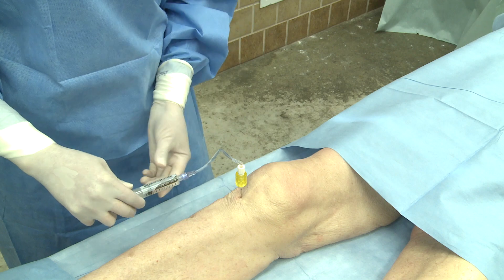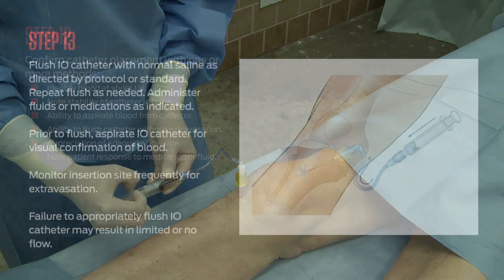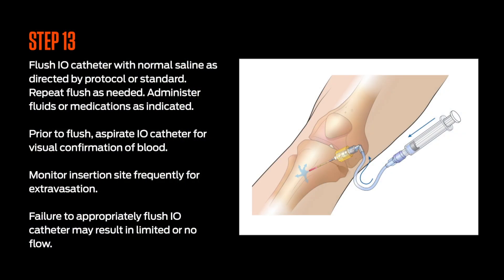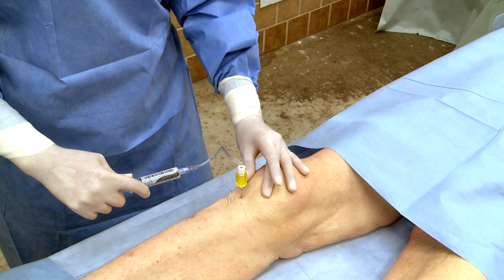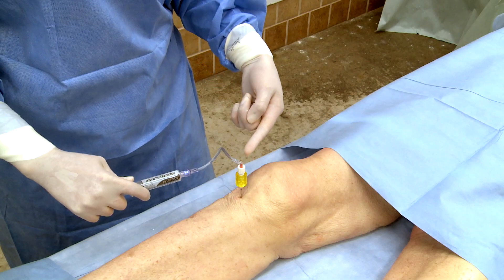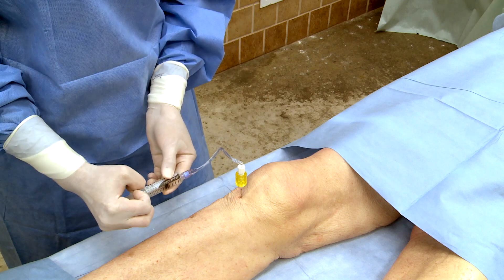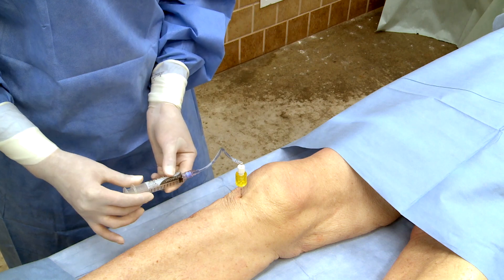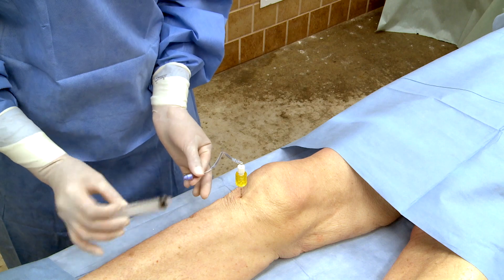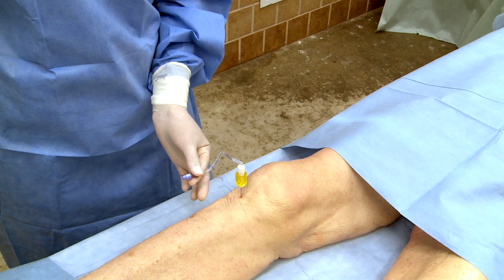Step 13: Flush the SAM-IO with normal saline as directed by protocol or standard. Repeat flush as needed. Failure to appropriately flush the SAM-IO catheter may result in limited or no flow. Once the SAM-IO catheter has been flushed, administer fluids and medications as indicated. Caution: monitor the insertion site frequently for extravasation, and do not leave the catheter inserted for more than 24 hours.